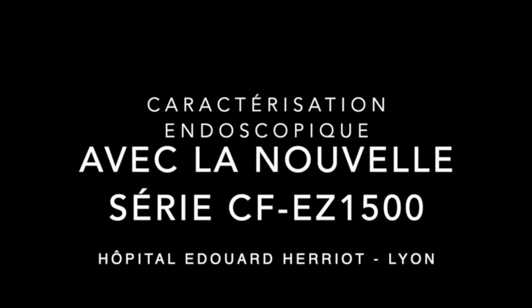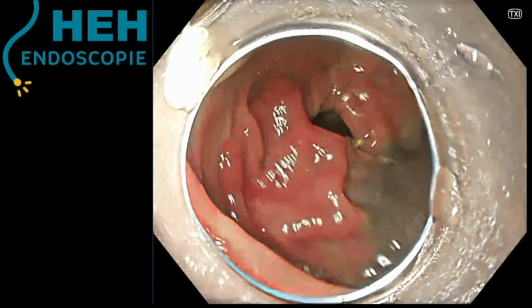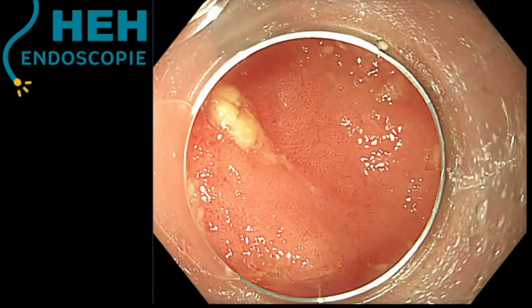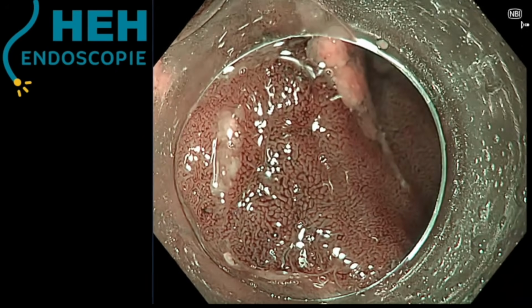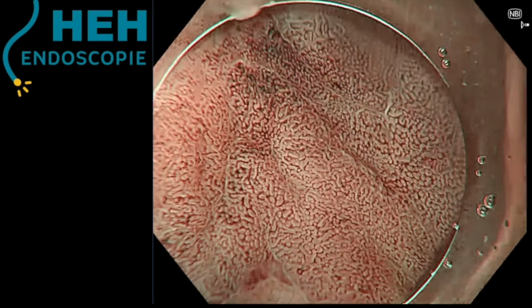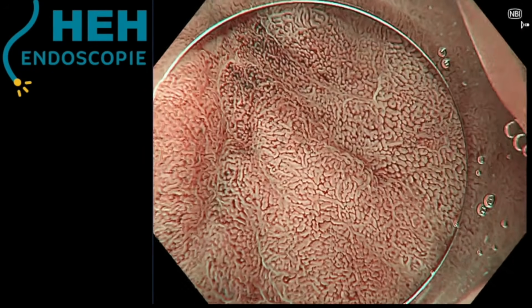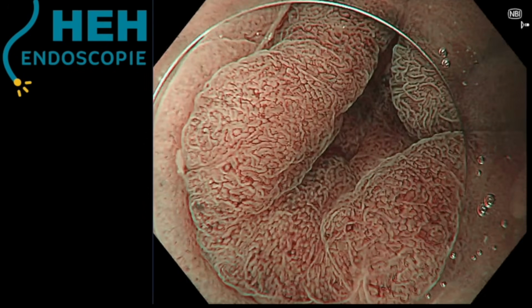Next case, an example which is a non-granular LST, which for me is a non-granular LST which is elevated. You can see that with the new scopes, with NBI in this case and zoom, you have a very precise assessment of the crypt and the vascular pattern.